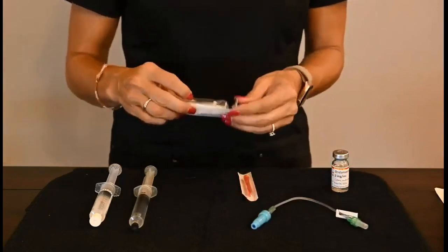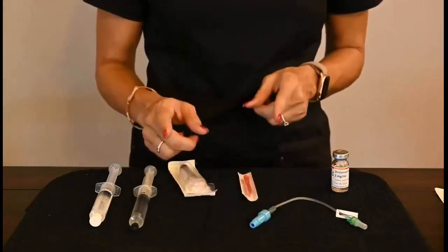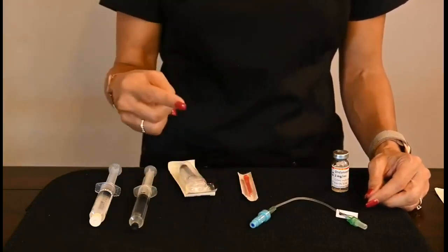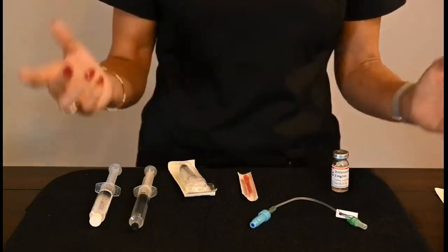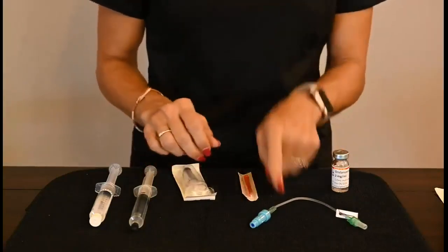So, my patient has what's called a saline lock. Remember, a saline lock means that they don't have continuous fluids or anything going through the IV at that time. That's what a saline lock means. So I have an order to give Zofran 4 milligrams IV push in a saline lock.